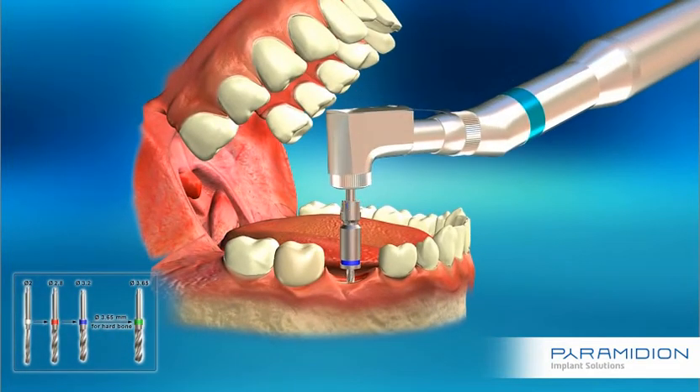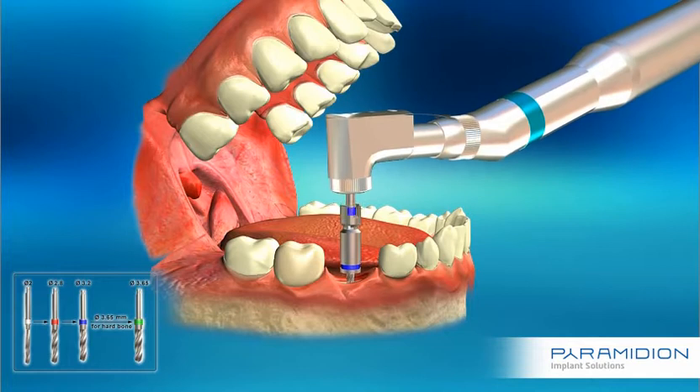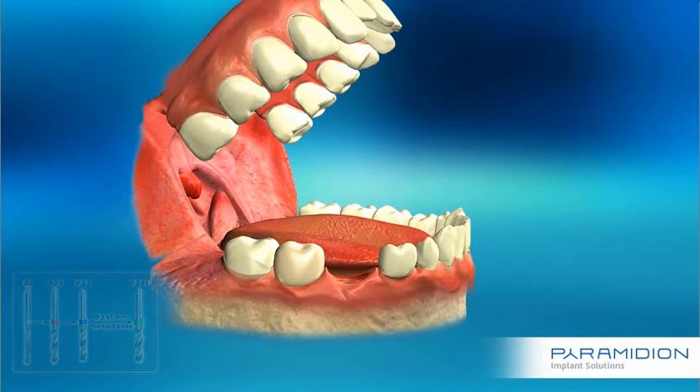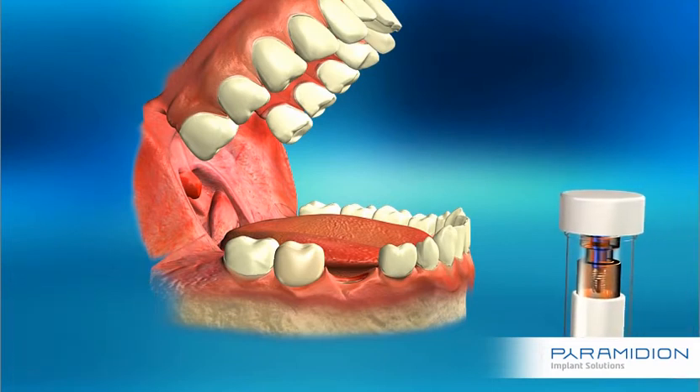Bone quality and planned implant diameter must be taken into consideration when choosing the final drill size. Take out the implant gently from the vial and insert it into the osteotomy.